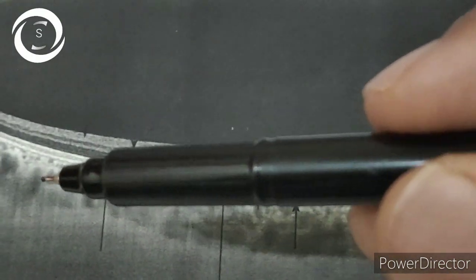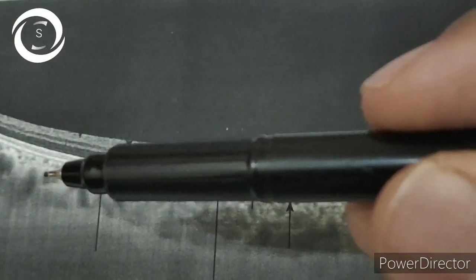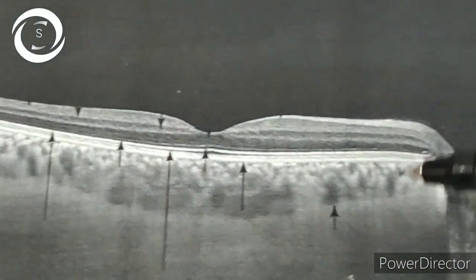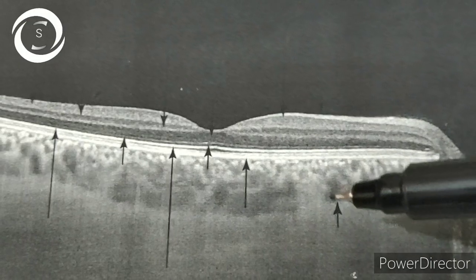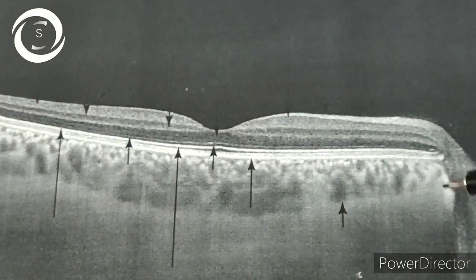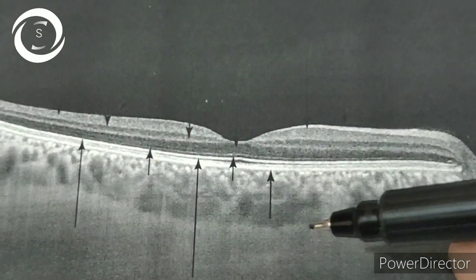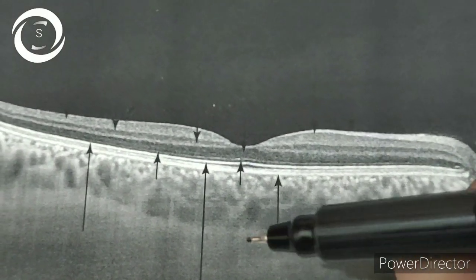Underneath these large vessels, the sclera is clearly visible. This is the sclera. So that's how a normal OCT macula looks like.